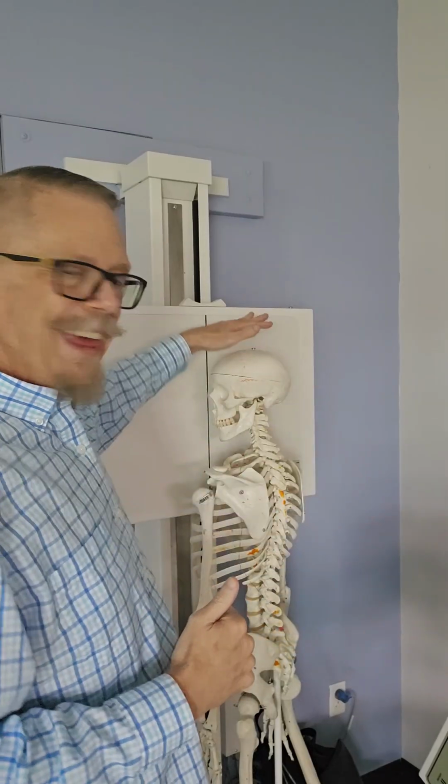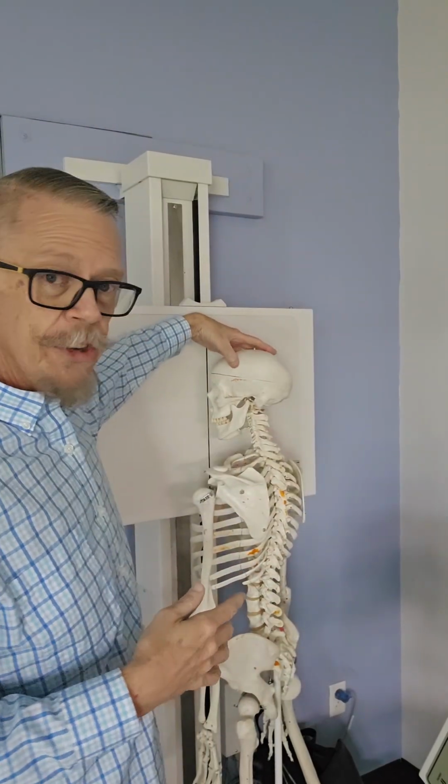But for the most part, I like to tilt the head a little bit and then apply a little bit less of an angle. It just depends on your patient's body habitus, but remember, 25 degrees is the most we want in total. Remember, that's a combination of tube angle and how much the patient's head is tilted. Again, rotate about 10 degrees towards the image receptor to take a good survey of the entire mandible, and leave it perpendicular, no rotation, to get a good image of the ramus.